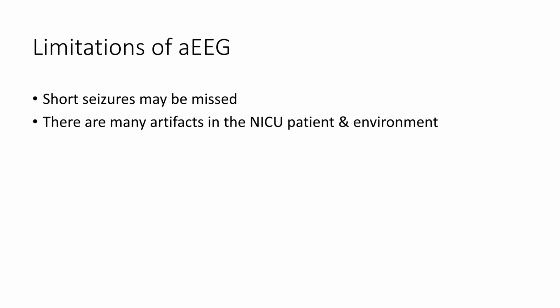So type in the chat, if you remember, I said, how many seconds is one line on aEEG? Do you remember what I said? How often it gets plotted? Every 15 seconds, exactly. So if it's only a 10 second seizure, or even if it's a 45 or a 50 second seizure, it can be missed because the time compression is so small. The other thing is that there can be these artifacts that we pick up that are potentially like seizures.